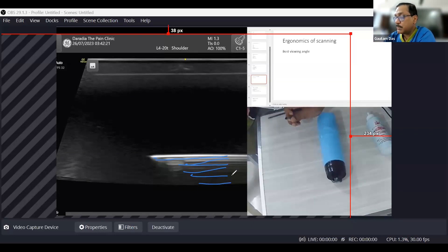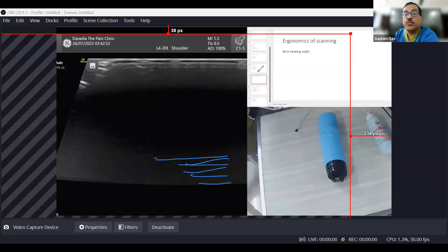To see structures better, make the angle less than 30 degrees. If it is not possible to reach the target at 30 degrees, take the entry point a little further away. How much further away depends on factors like target depth and patient obesity — experience will help you judge these distances.